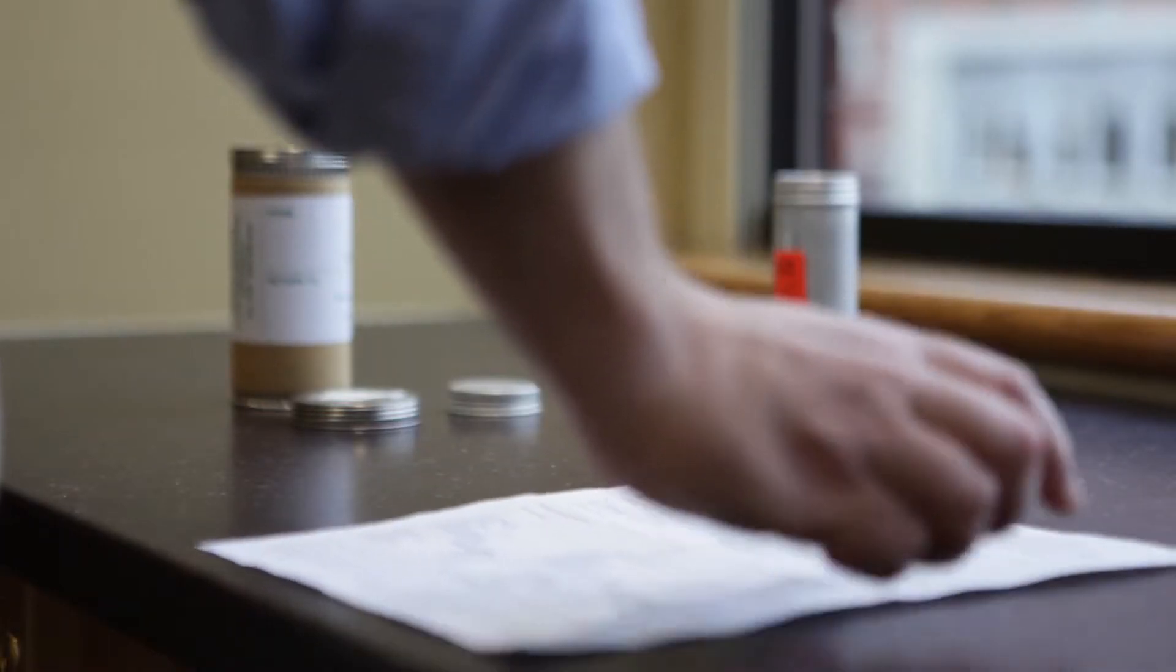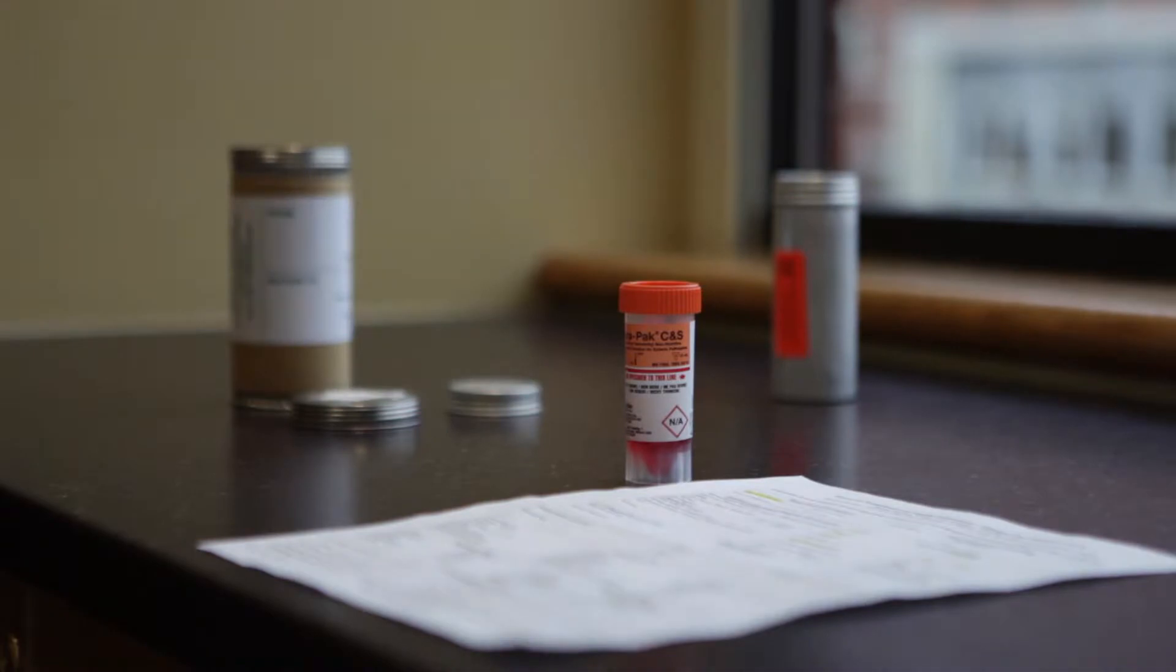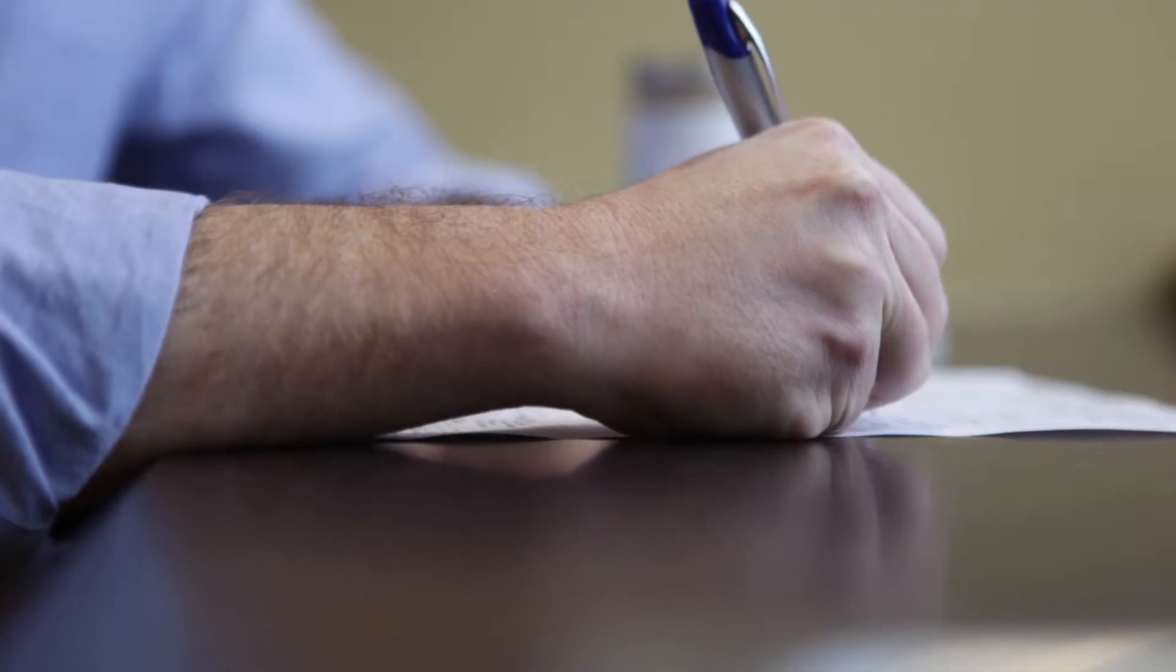It's important to follow the proper steps to make sure we can test the sample accurately. You will be given a kit that includes a clinical test request form and a plastic vial for collecting the sample.